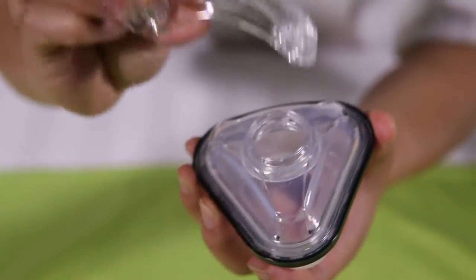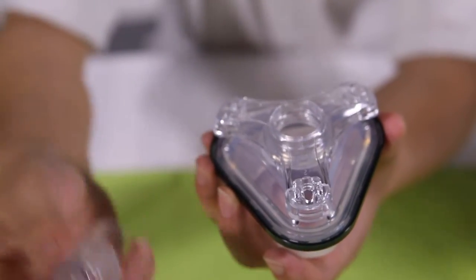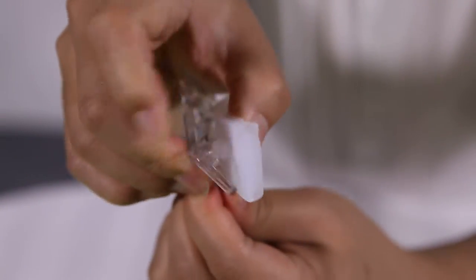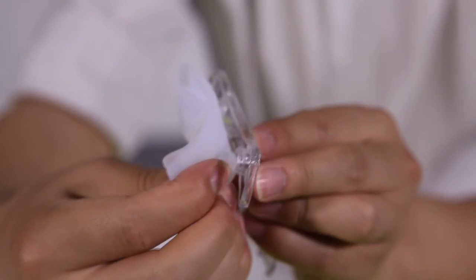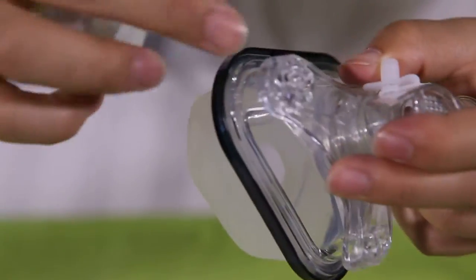Attach the cushion assembly to the mask frame. Push the cushion assembly onto the mask frame firmly until the latches click into place. Place the forehead pad plugs into the two round holes of the forehead support. Adjust it to the proper position and plug the forehead support frame into the mainframe slot.